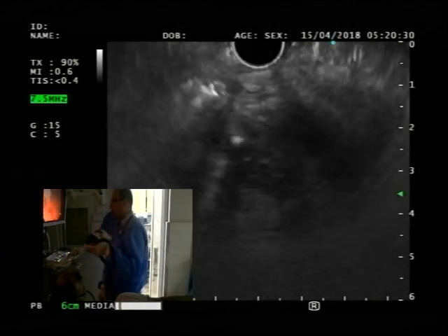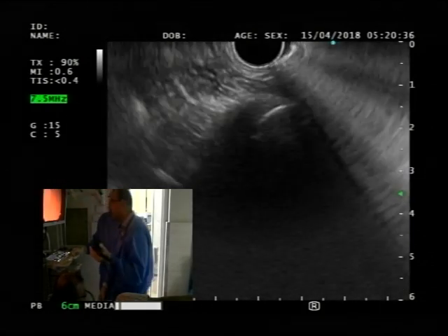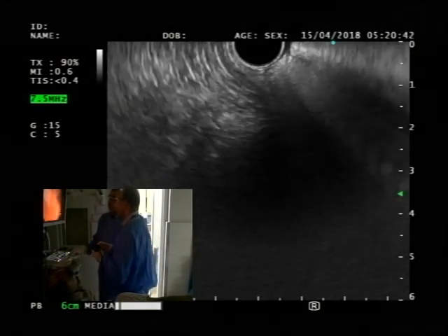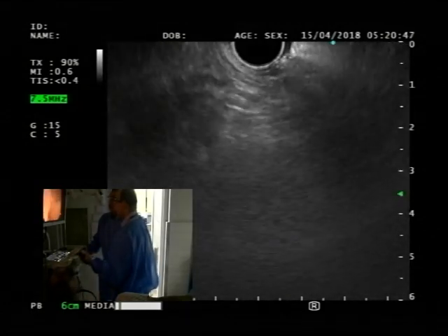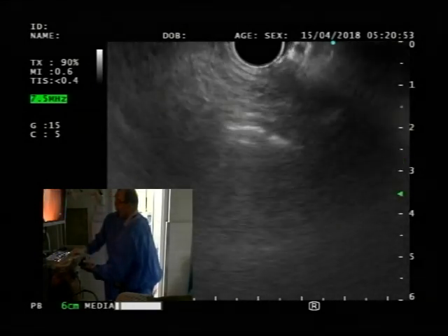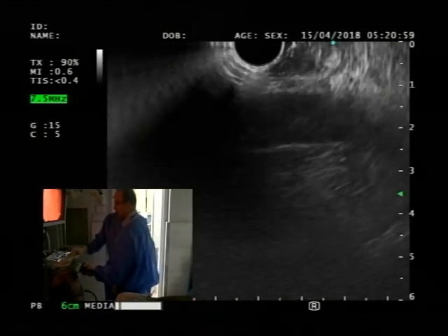Do you normally ask your assistant to hold the scope when you're in the position when you are doing this? No, usually I have full control of the scope. I'm a control freak. If it's a very unstable position, I do need somebody. The problem is when you have a certain angle at which the scope needs to be rotated, it can be very hard for the other person to know which way to go. So I personally tend not to do that, but obviously there's no harm in doing it. Yes.